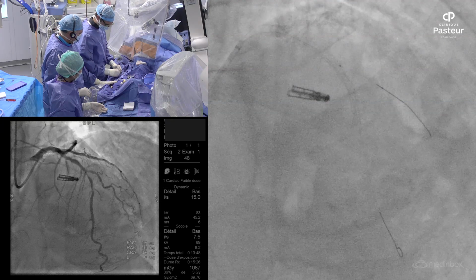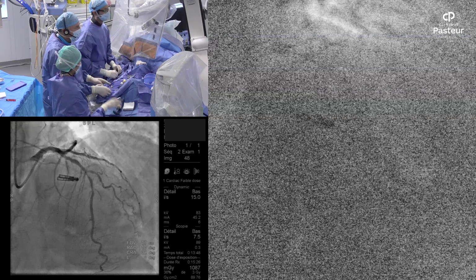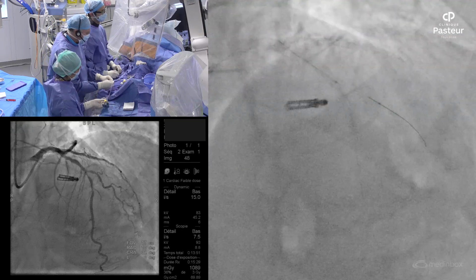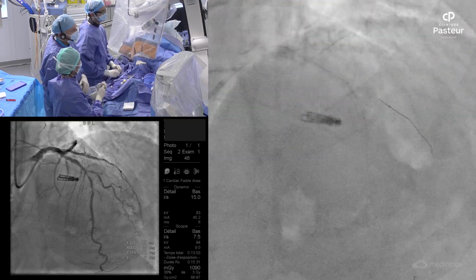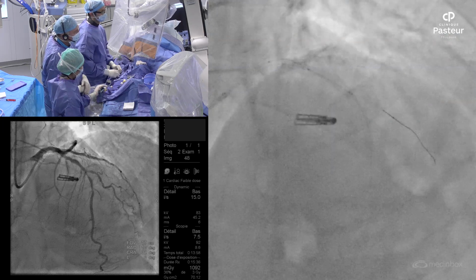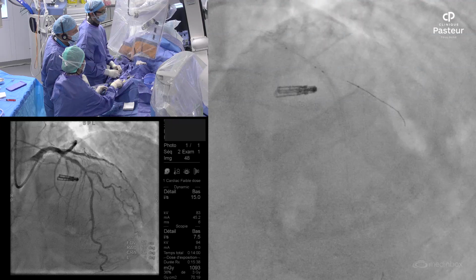But I think, Bruno, that when you presented your strategy, you planned to do a final imaging. Yeah, that's right. Because it's so calcified, we will do that. Yes, if we have time, because sometimes with the live, we never know if we have enough time. But for the moment, it's okay.